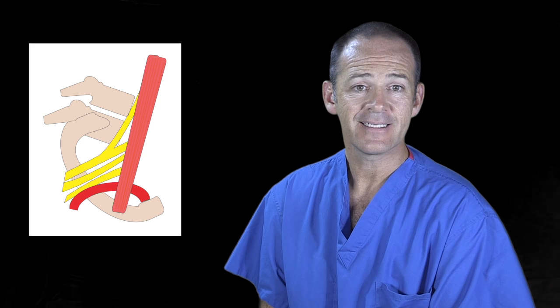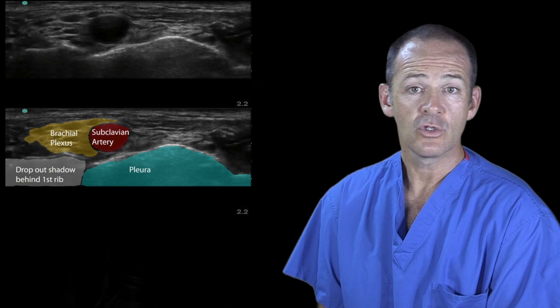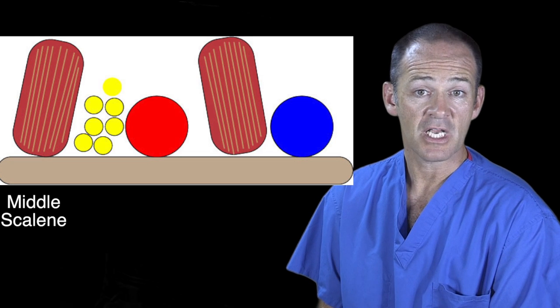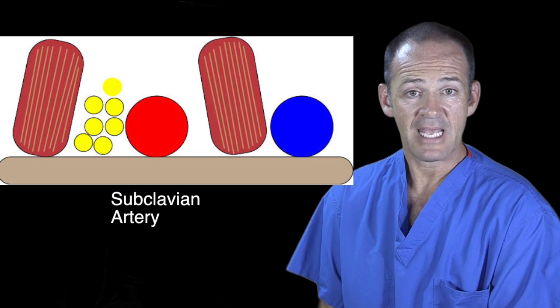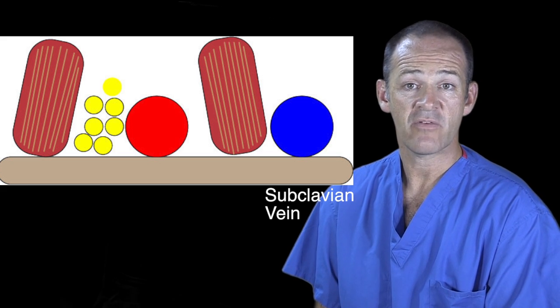The nerves are located lateral to the subclavian artery, occasionally superior to it. Looking from lateral to medial along the first rib, the important structures for this nerve block are the middle scalene muscle, then the brachial plexus, next the subclavian artery, the anterior scalene muscle, and then the subclavian vein.